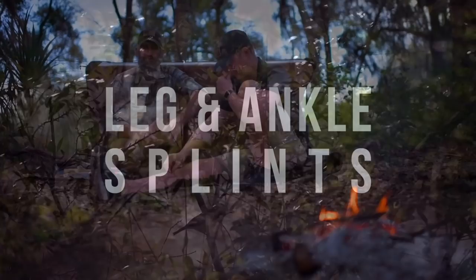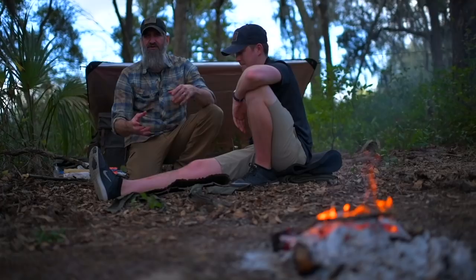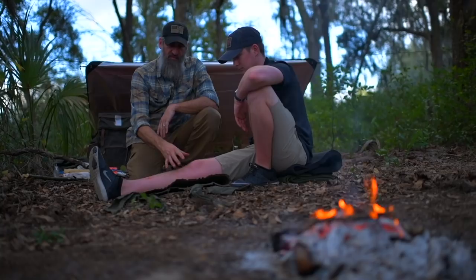Another splinting technique you can use: if you don't have an Insulite closed cell foam pad, you can actually use an air mattress to create an improvised air splint technique using an inflatable mattress. Very similar to how we did it with the Insulite pad, I can make an actual immobilizer with this by adding some rigidity to that.